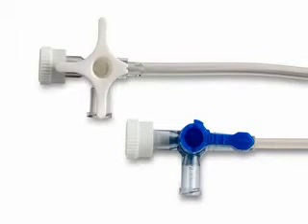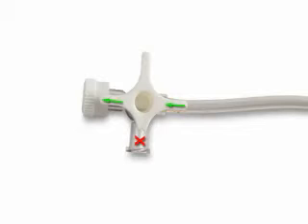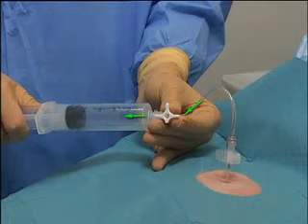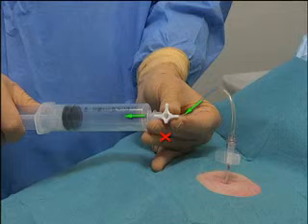Numerous models of stopcocks exist, and you should be familiar with those used in your institution. The three white arms of the stopcock used in this video point to an open side port, while the side without an arm points to an obstructed side port with a closed end. When air is being aspirated from the pleural space, the stopcock should be open between the patient and the syringe, but closed to the ambient air.